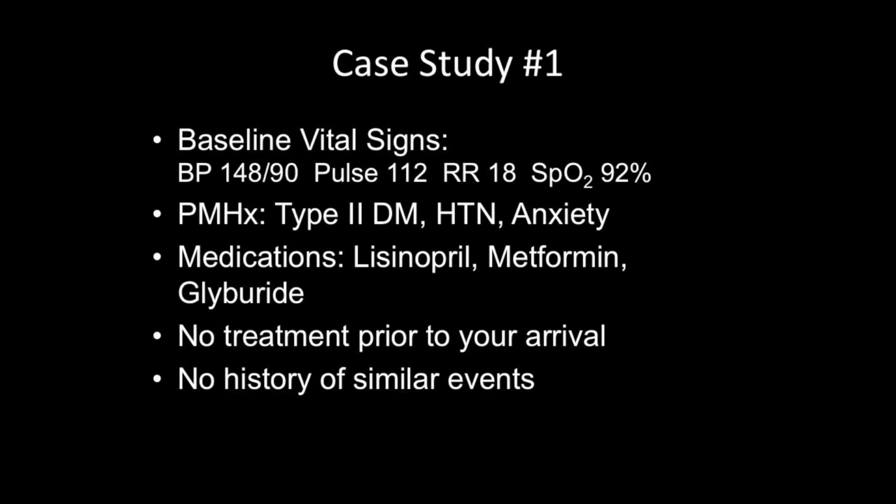Odd. Okay. She's tachycardic. She's vomiting, so she should either be on the slow side, right? Because when you vomit, vagus nerve and all that, but whatever. So she's tachycardic, and then she's only 92%. When you look at this and look at this, there's no respiratory illness in here, right? So why is she only 92%? Some of these are not big clues, they're small clues. You just have to look for them, right? So she's probably not well right now.